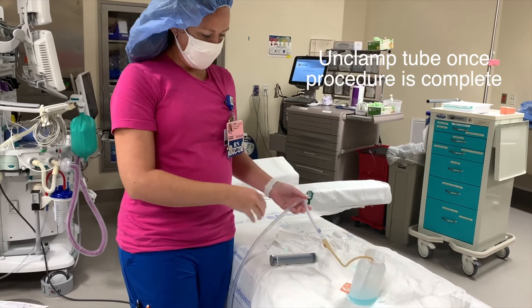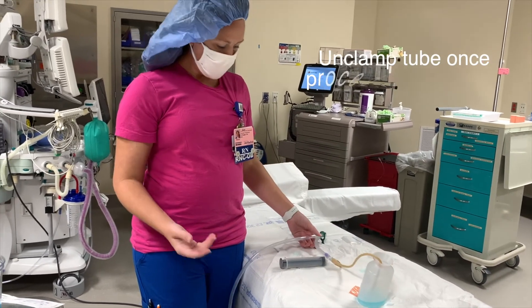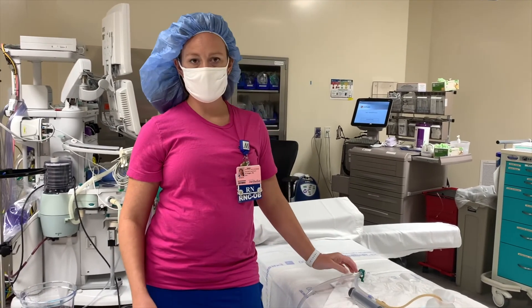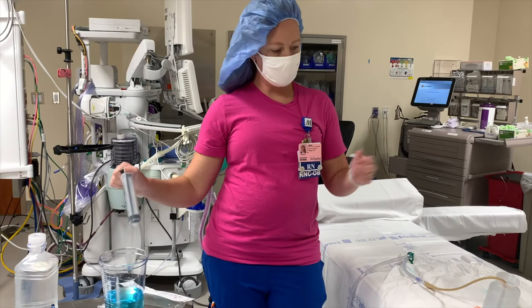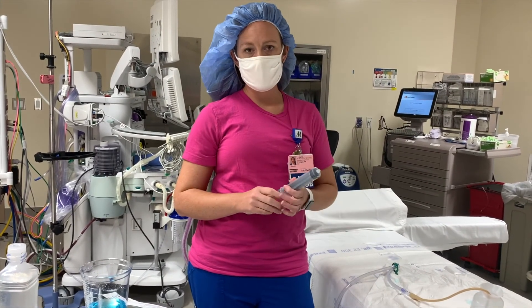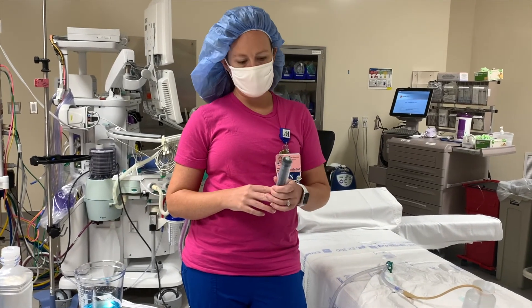If you have extra staff — an extra transition nurse, a charge nurse, anybody — you can get two 60ml syringes, and one person draw it up and one person infuse it. That'll just help it go faster if you're having to use a lot of methylene blue. You can do it by yourself too. Thank you.